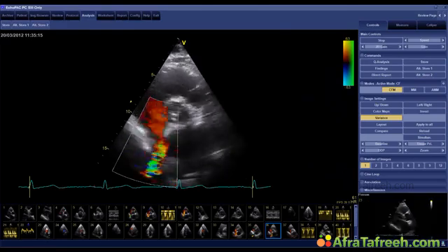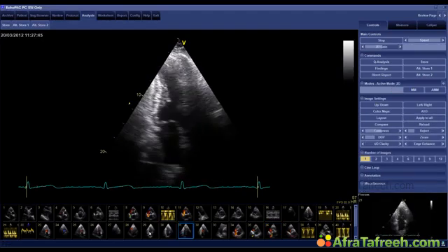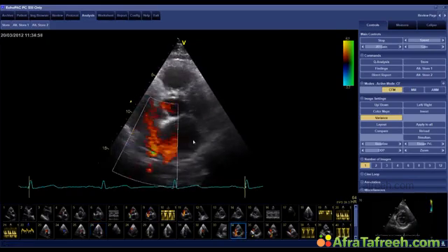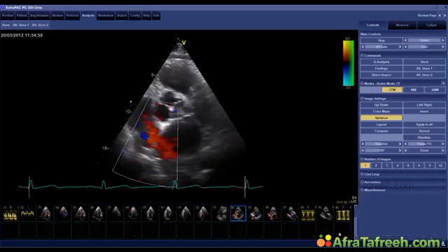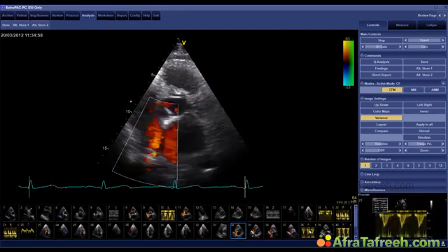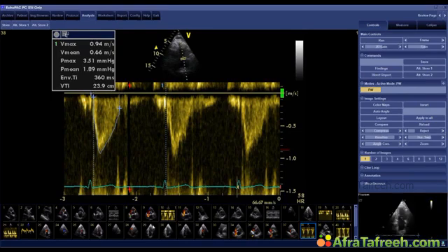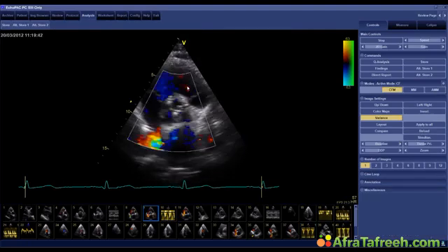One of the major things is that if you see such a strong color flow where you think it's an atrial septal defect, it would mean that it's a fairly large ASD. And if a patient has a large ASD, you would expect a large right ventricle. This is certainly not the case. The right ventricle is of normal size here. This is maybe difficult to see here, but if you take a look at the right ventricle here, or in a subcostal view, you will see that the right ventricle is actually normal in size. The second reason is that he has normal flow across the pulmonic artery. Here, this is the velocity time integral, which is not very high, and he also has a normal size of the pulmonary artery. So this also speaks very strongly against an atrial septal defect.